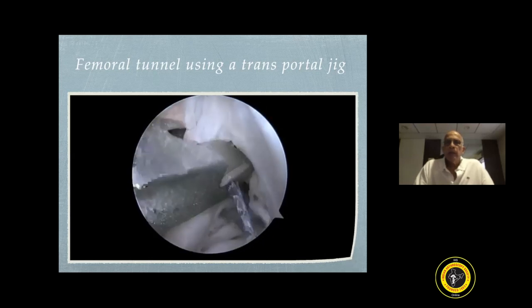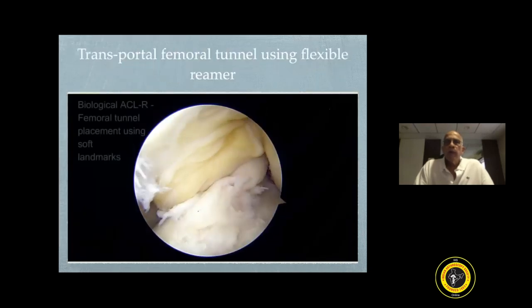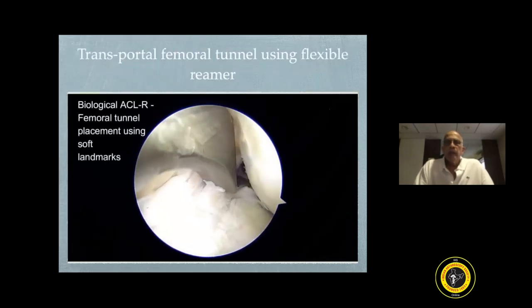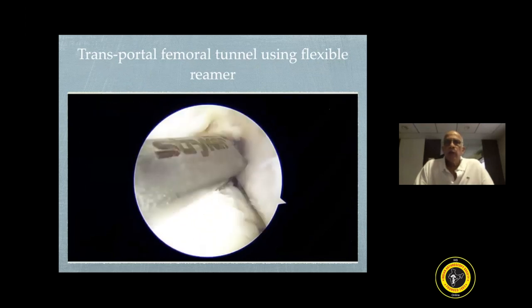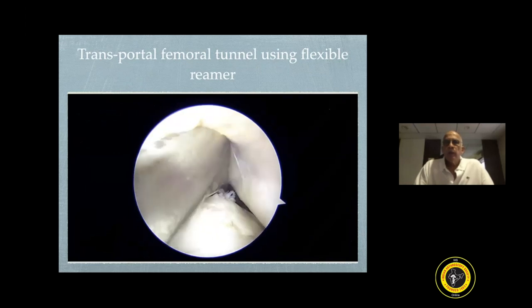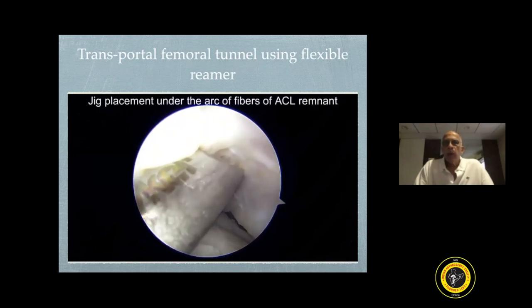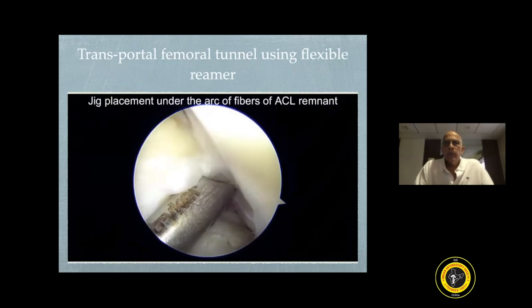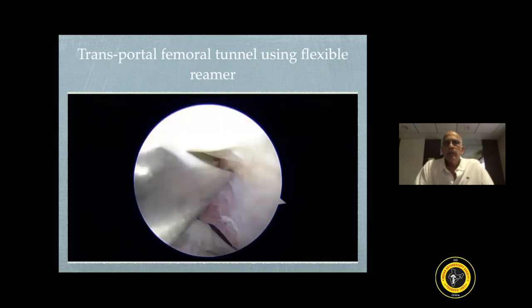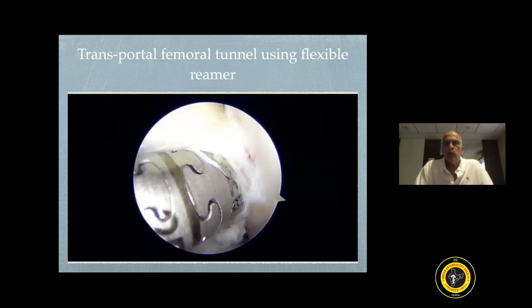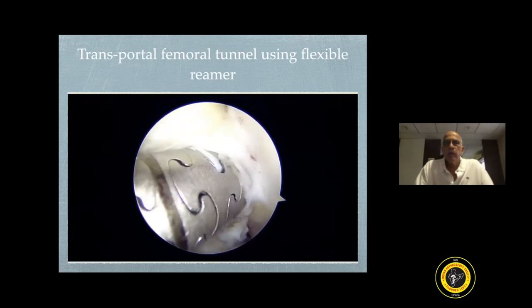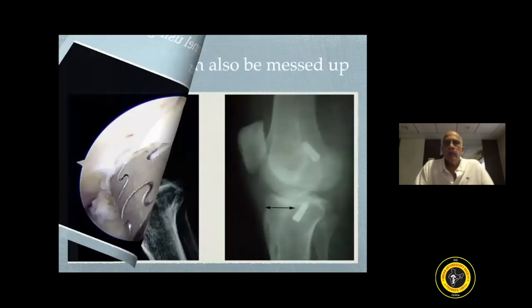The third method is by using flexible reamers. There is a special jig which is introduced from the anteromedial portal. This jig allows a flexible nitinol wire to be introduced. The jig is placed under the remaining fibers of the ACL. As you can see, there is an arch above the wire that you have introduced, and then the appropriate size reamer is progressively used.